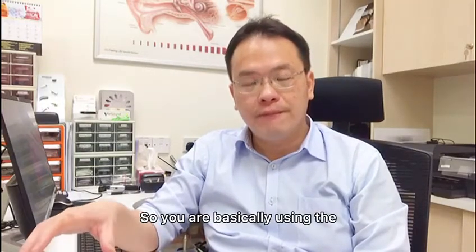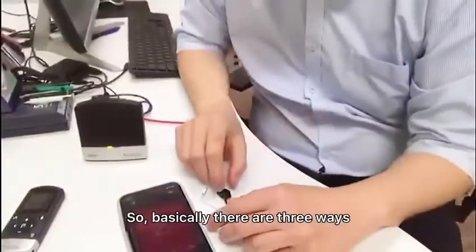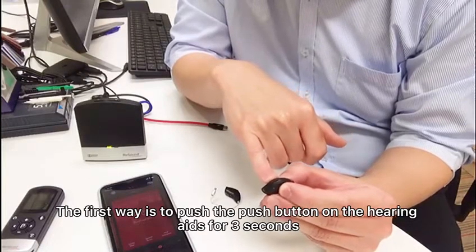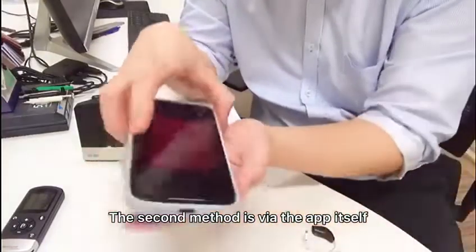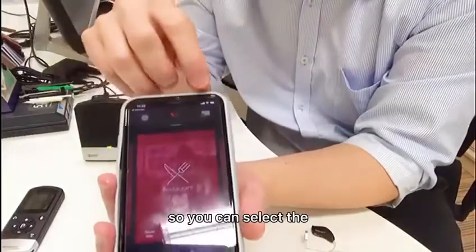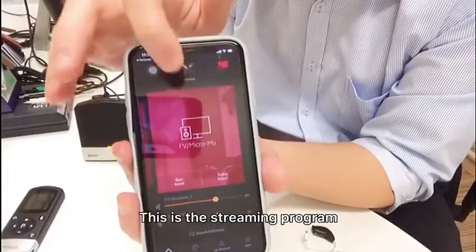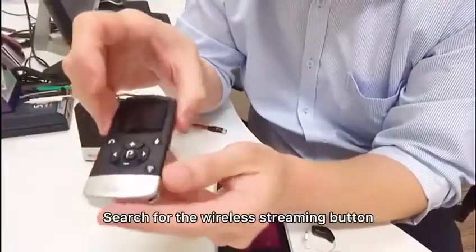There are three ways to activate the streaming program in your hearing aid. The first way is to push the button on the hearing aid for three seconds — press and hold — and it will bring you to the streaming program. The second method is via the Smart 3D app, which can be downloaded onto your smartphone. You can select the streaming program on the app, which will bring you to TV and micro mic — the streaming program.